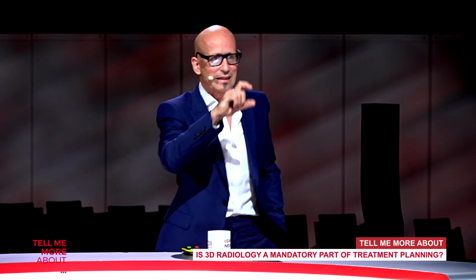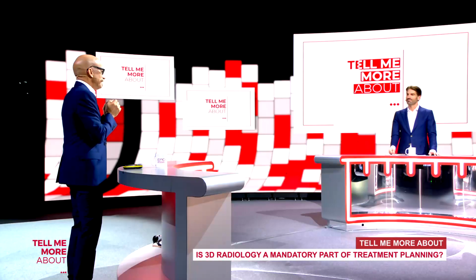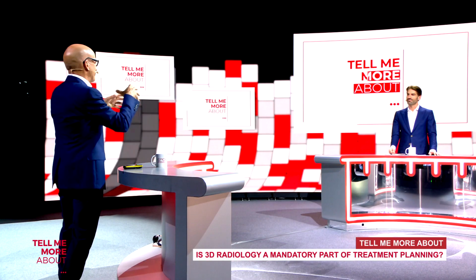I mean, we discussed today 4 or 5 millimeter implant length. Some companies offer you 4 millimeter, some 5. But then you assume you go as close as possible to the nerve. In my opinion, there, it's true, you need to be a clinician. Honestly, in situations like this, it's not only that I have a guide, a static template, to give me the inclination of my implant and the position, but also, when I prepare the hole, I go and look on the monitor, where is the bone?